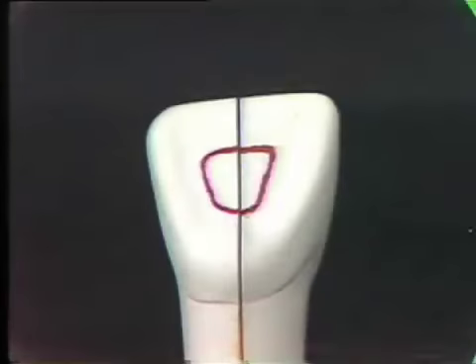In the clinic, the first thing that you would do before access preparation is to swab the tooth in the area with tincture of merthiolate. Here, working on the model, we'll skip that step. The second step is, once again, to visualize the pulp, its position, its shape. Really get a picture in your mind of where you're going with the tooth, and don't start until you're pretty sure you have it. If it'll help you, you can outline on the tooth with a pencil what you expect your tentative outline form to be.